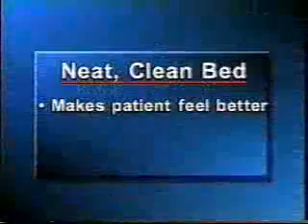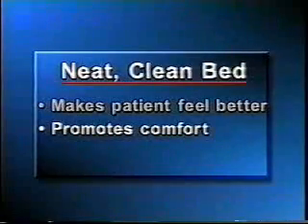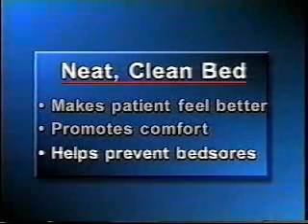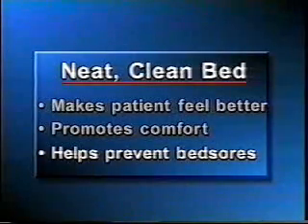Bed making will be a frequent responsibility of you, the caregiver. This responsibility includes making sure the bed is both neat and clean. A properly maintained bed makes patients feel better. It also promotes comfort and helps prevent decubitus ulcers, also known as bed sores.